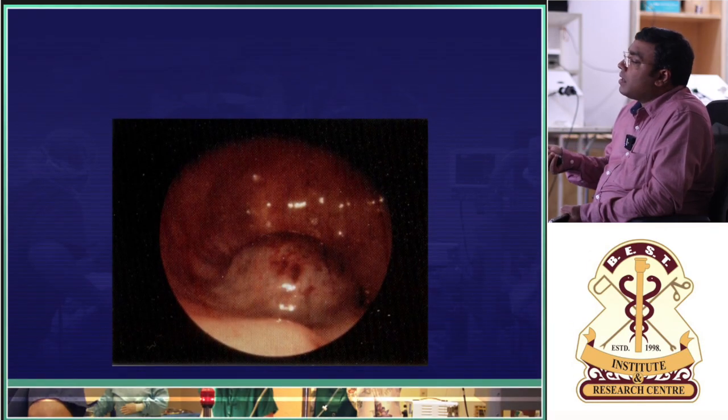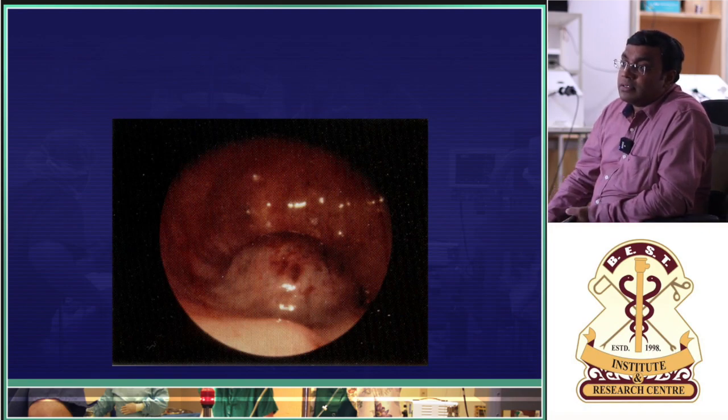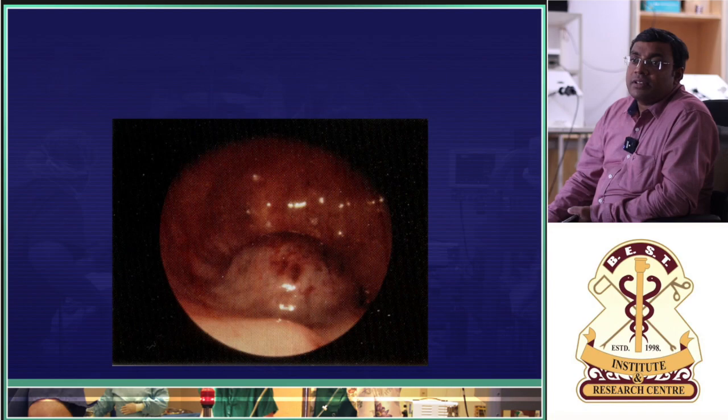What is this? Submucous myoma. What type? Any differential diagnosis?